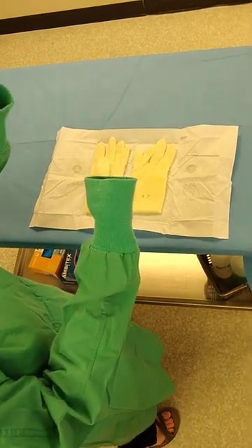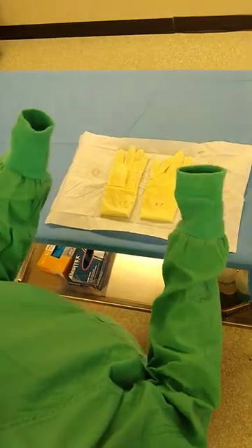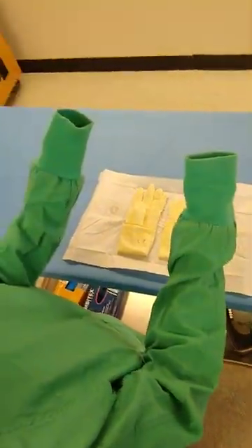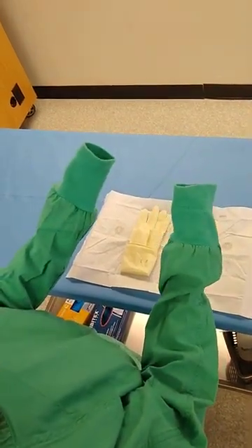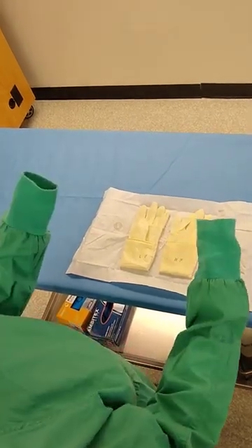The closed gloving process has a few more steps to it, but it's not really that much more difficult. Your hands are going to be already in your gown — you want to make sure your fingers don't peek out the top, so keep them nice and neat inside.